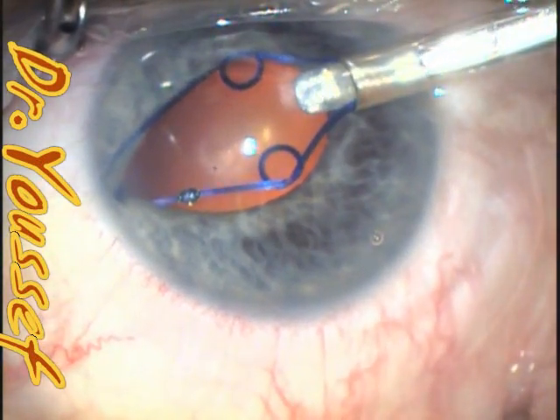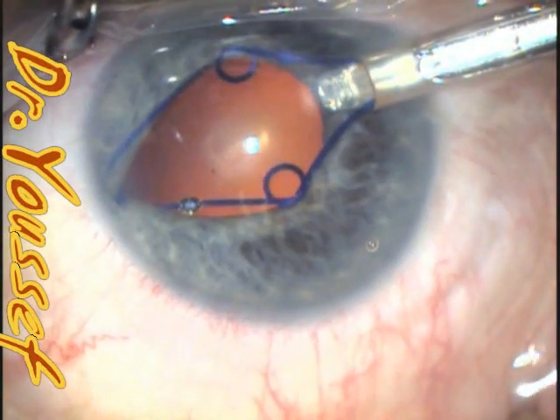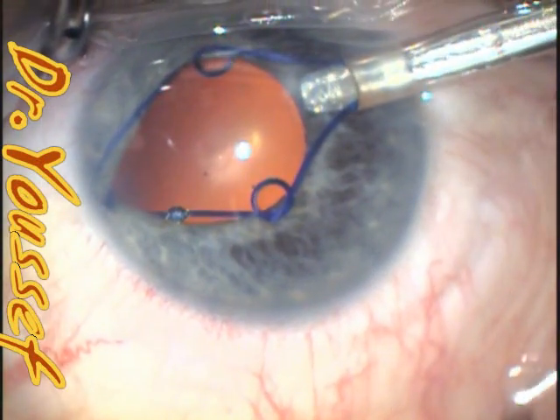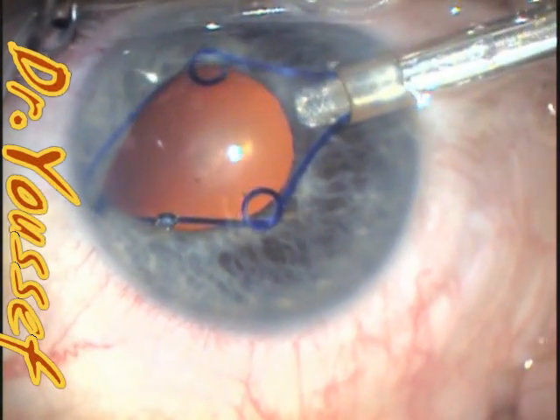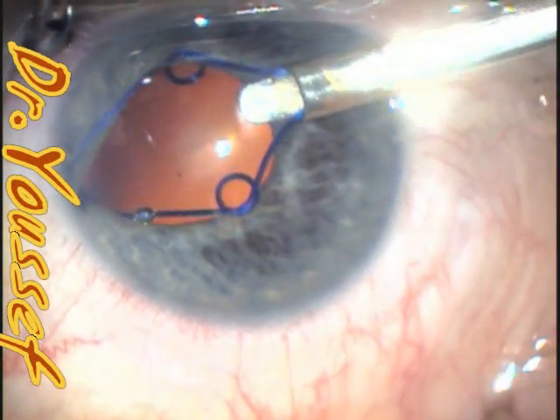At this stage, I rotate posteriorly upwards a little bit to engage the upper one, and then the same for the lower one. I rotate the injector a little bit to engage them at once.